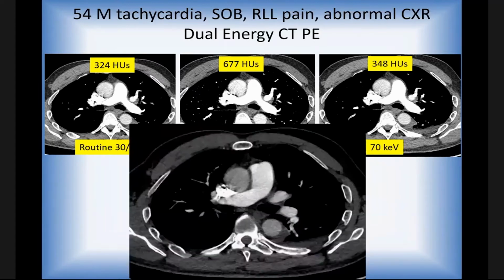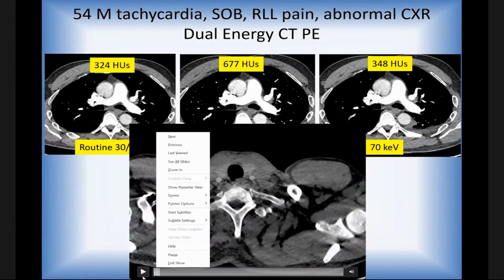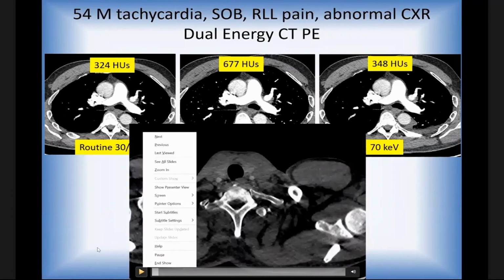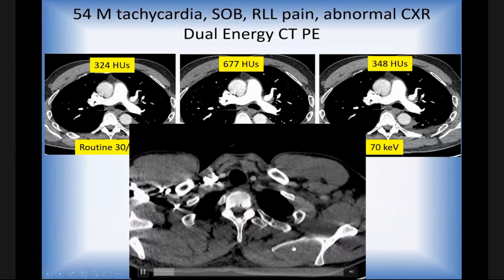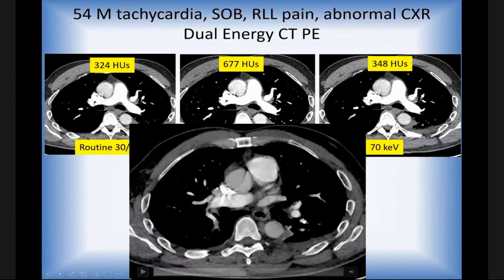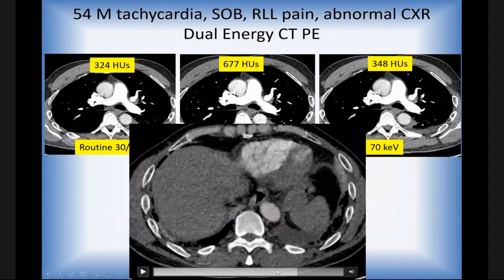And this is the same patient. So this is the dual energy CT. We can see that the patient has a little bit of embolus here.